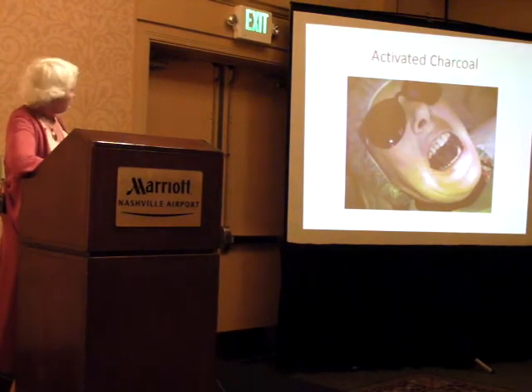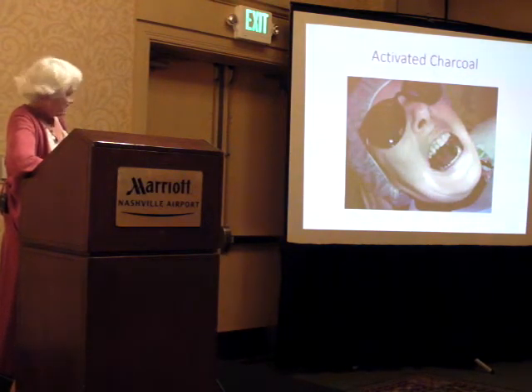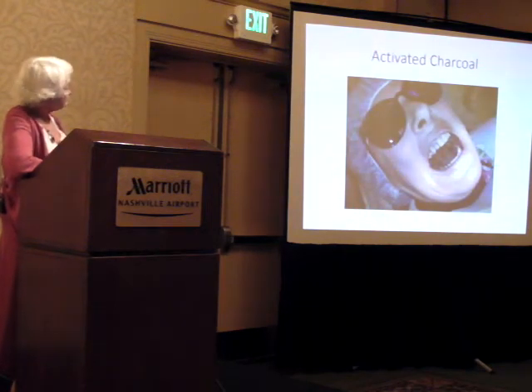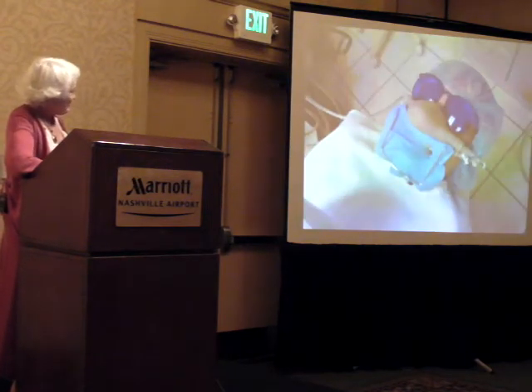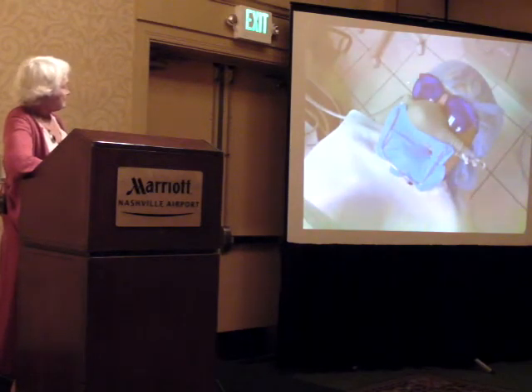So there's one of my patients with her activated rinse. She's got her glasses on and carrying on there. There she's got her mask. Dam is on, and she's got the hood, separate air supply.